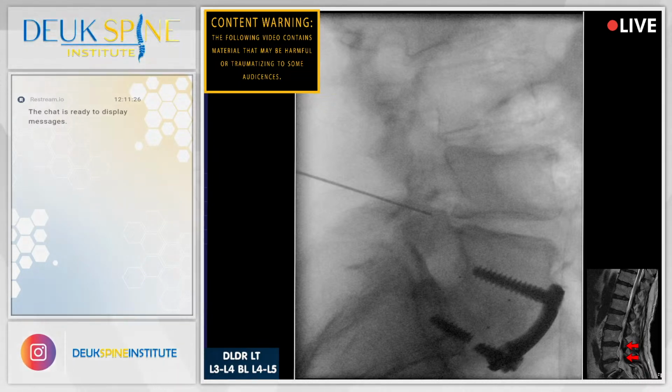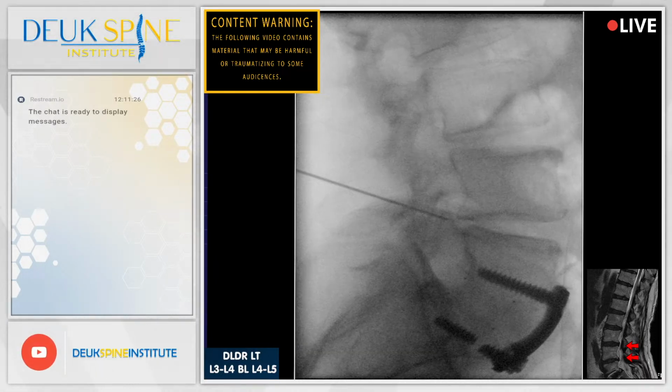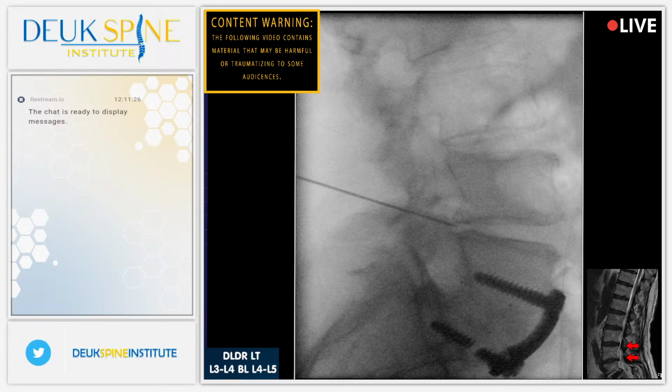All right, Jordan, I think it's looking pretty good. Is our patient reliable? Shot? Any pain? Any pain? Nothing? Should I wait a few more minutes? Huh? Yeah, another couple minutes. All right. So let's go ahead and go from the other side.